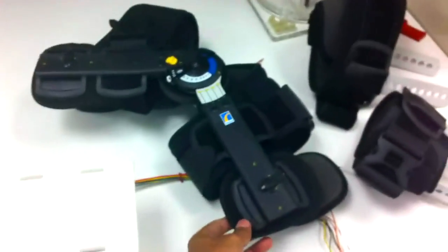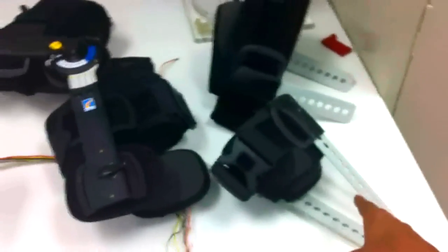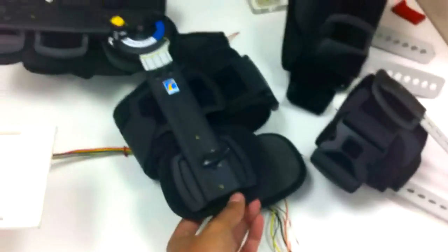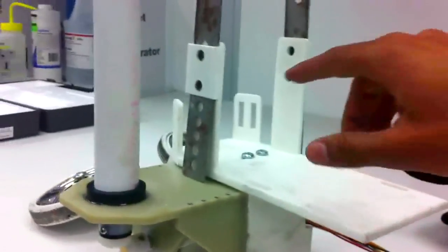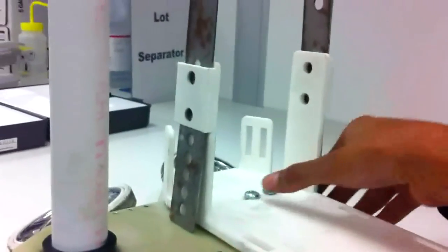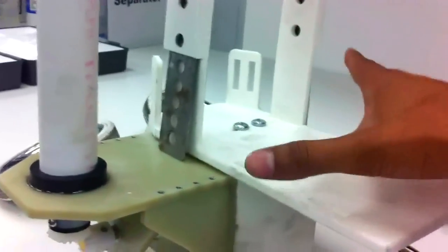Okay, over here we have the Össur DLX knee brace. We can slip off the ends of the knee brace, which are sitting right here, off on the side. And we can couple the knee brace to these brackets on the footrest, which is this design right here. There'd be straps coming out right here. A support for the back of your heel. The footrest is adjustable to accommodate different size feet to width.